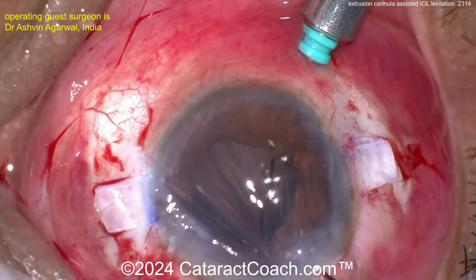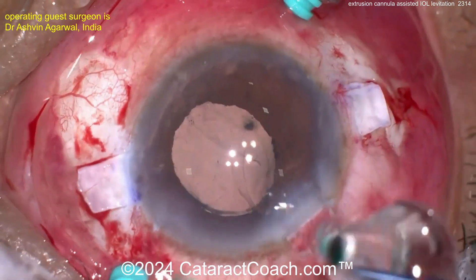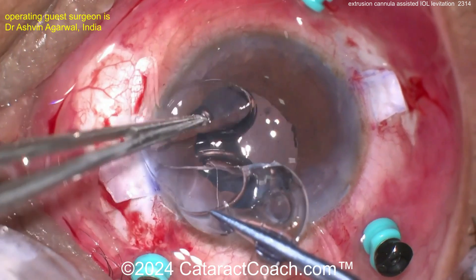Now the old lens is cut in half and brought outside — bring each piece out. If you leave it partially attached, you can just bring them both out together; they're still coming out together. So don't cut it all the way through — I like that technique. Beautifully done.